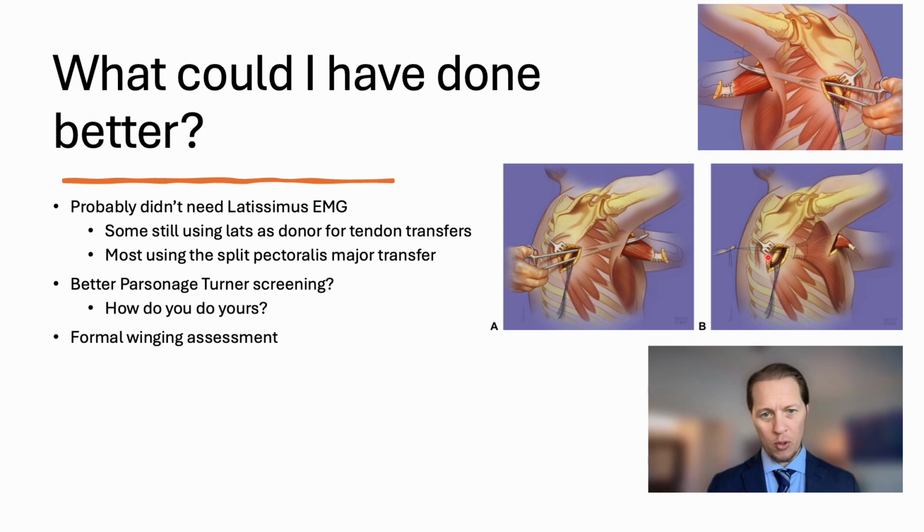If we're going to do a formal winging, well, maybe we should have added the sternocleidomastoid. I didn't do it. It's an uncomfortable one. It can also be a little bit scary when you're doing and you're not used to doing those.